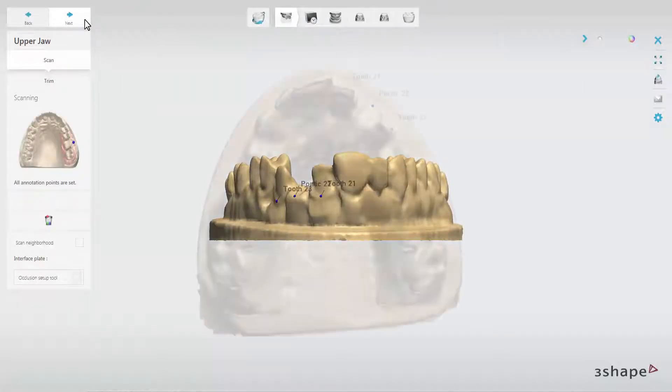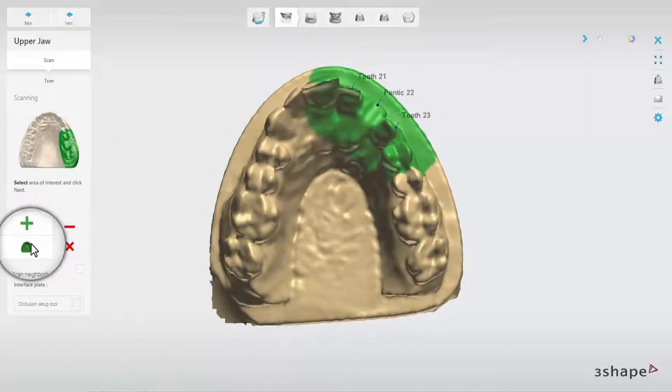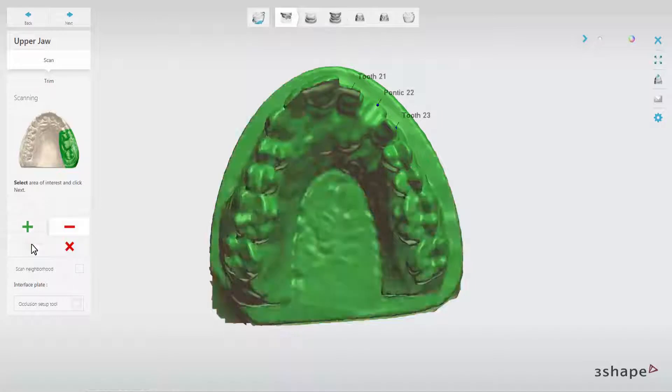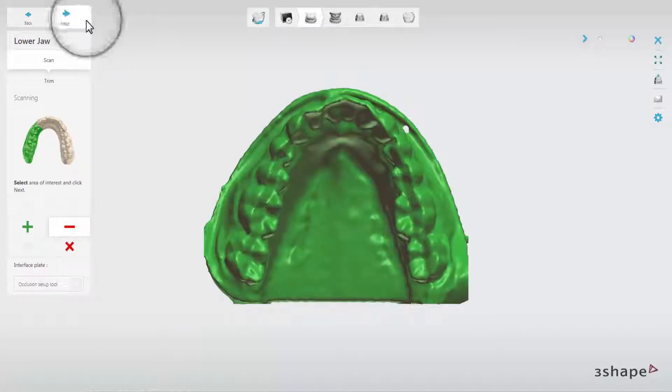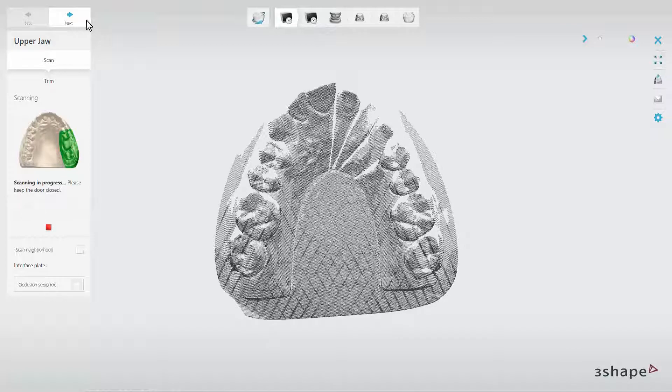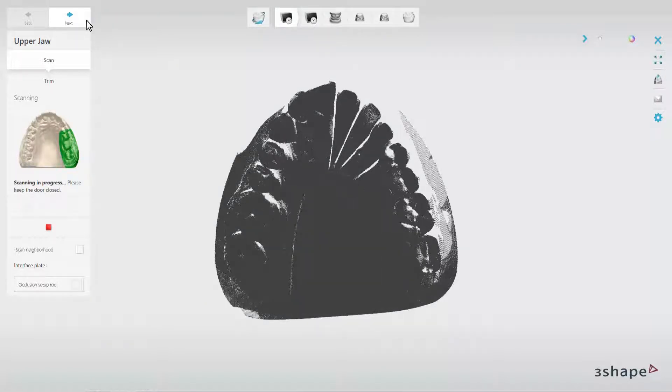The scanner will first scan the upper model. On the initial scan, set the annotation and select the scan area. Then select the scan area for the lower model and click Next. The die will be scanned at the same time if the Scan Die in Arch option is enabled.